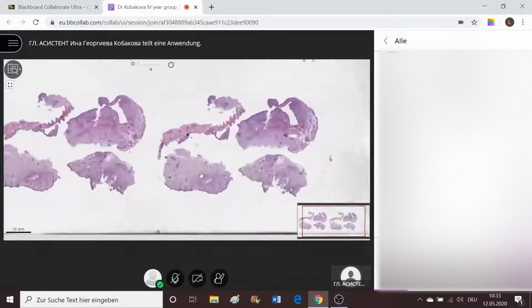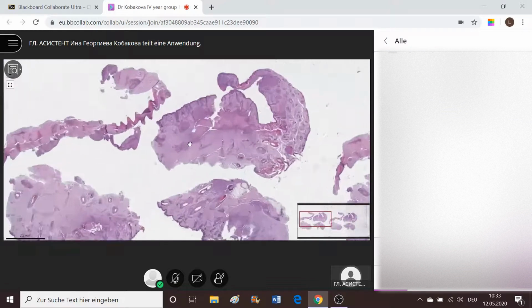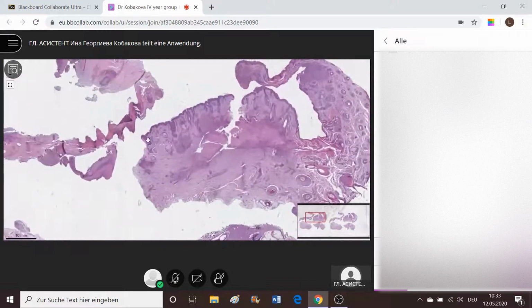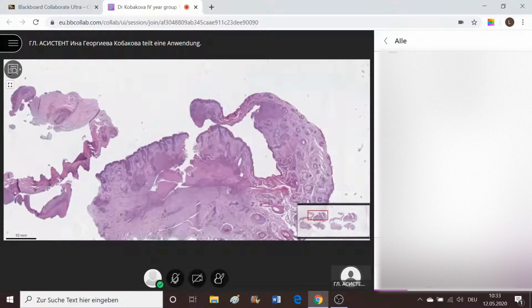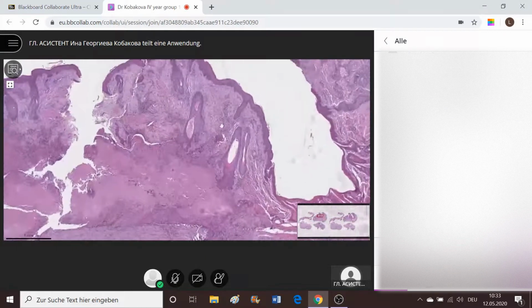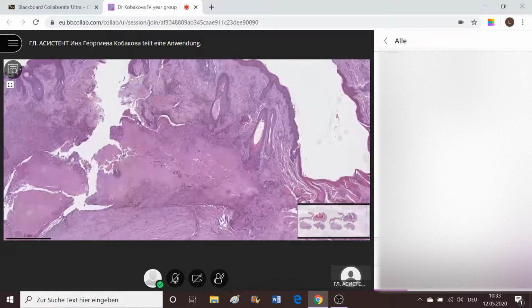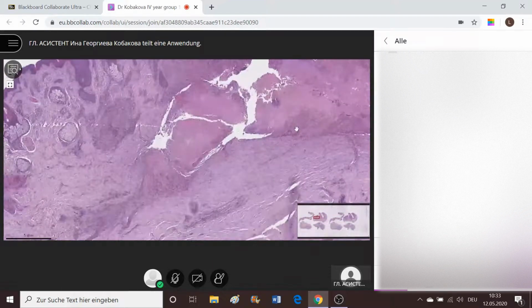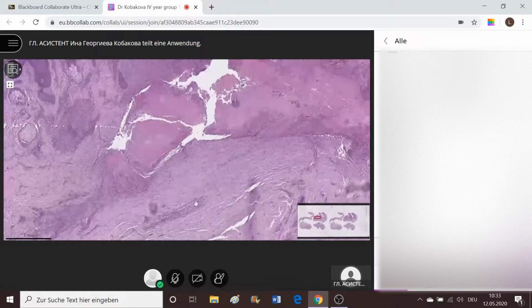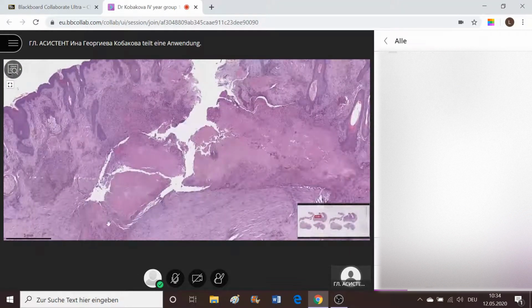That is an abrasive technique of taking samples from skin. As far as you can see here, there are lots of squamous epithelium covering the material, which is actually covered by keratinized structures, which speaks to me that that's skin. What we should observe here are huge fields of caseous necrosis.